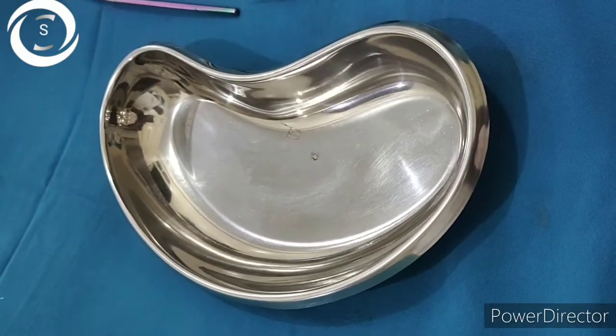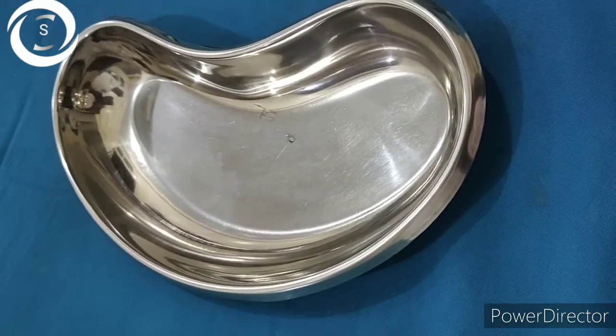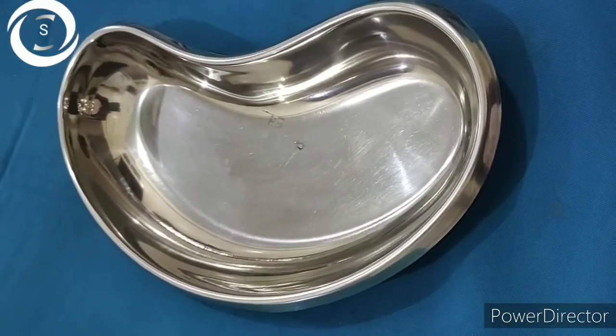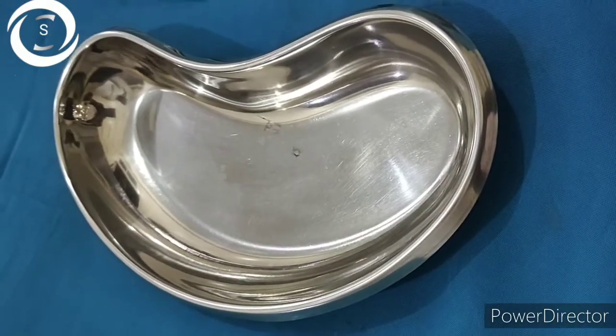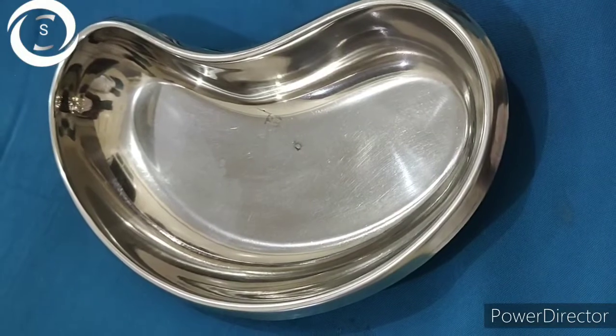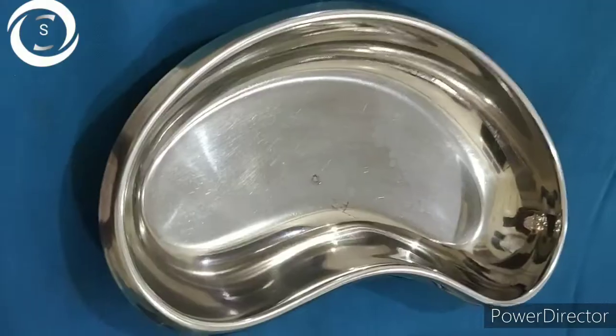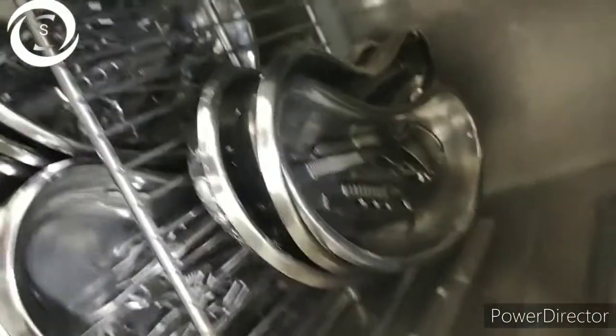Today we will discuss ophthalmic instruments used in cataract surgery. This is called a kidney tray — it is a kidney-shaped tray where instruments are placed and then sterilized in the autoclave or hot air oven.